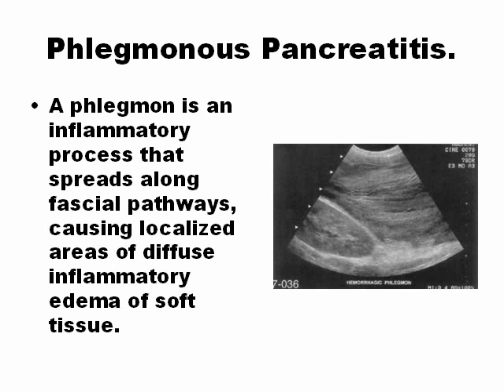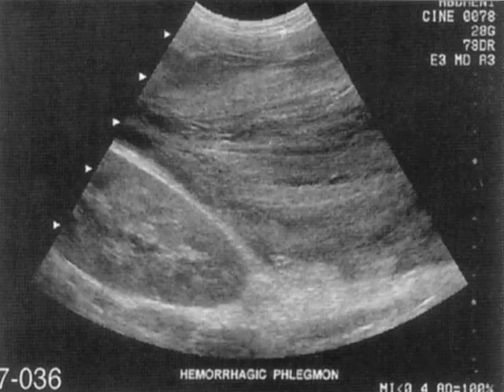Phlegmon is a diffuse inflammation of the soft tissue. Phlegmonous pancreatitis is characterized by inflammation around all the connective tissue that surrounds the pancreas — a diffuse inflammatory edema of soft tissue around the pancreas, created by pancreatitis. This is one ultrasound of a phlegmon. You can see only the edematous tissue and the kidney, but you cannot see the pancreas in this picture.